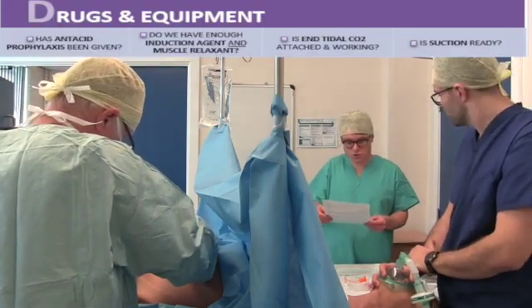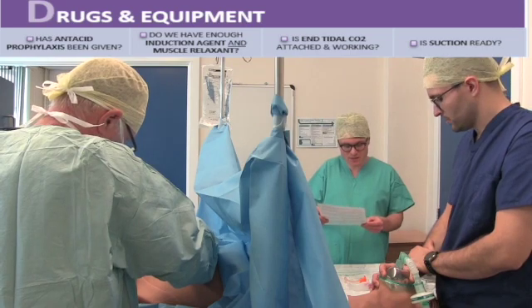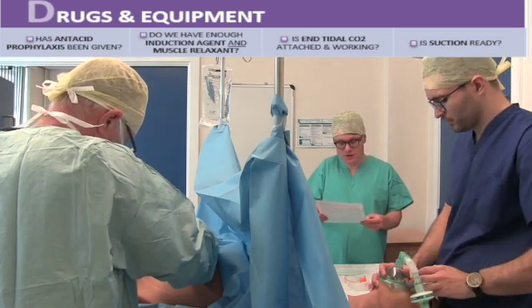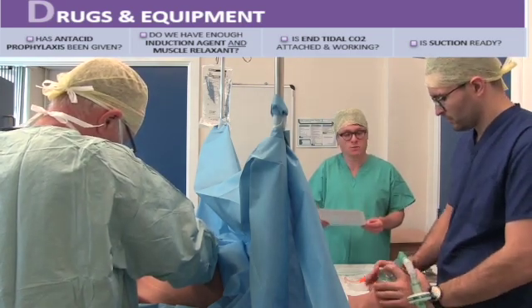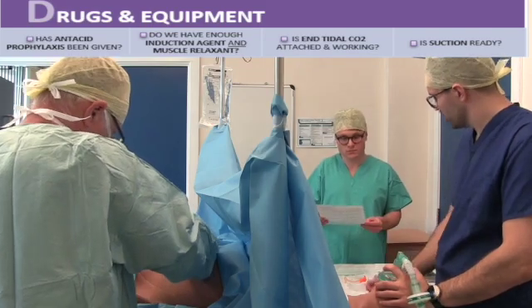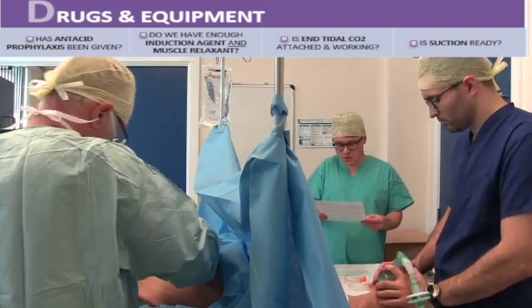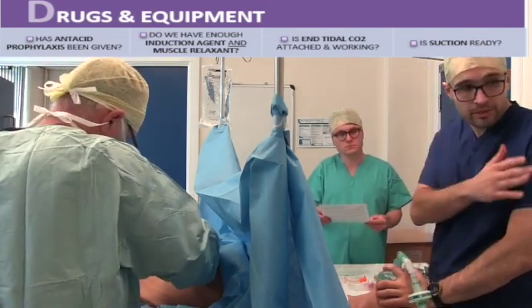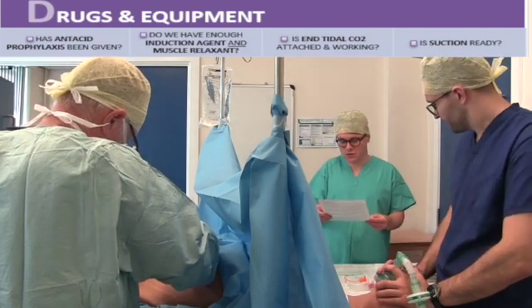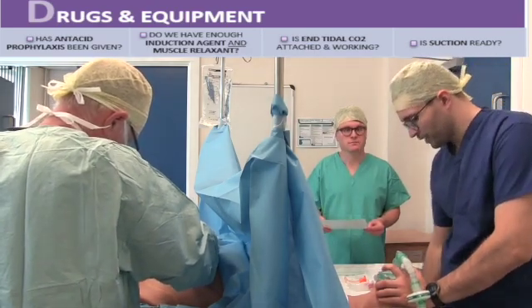And final section, drugs and equipment. Has antacid prophylaxis been given? Yeah, before we came in the room. Do we have enough induction agent and muscle relaxant? Yeah, so I've got thiopentone and rocuronium. And is end-tidal CO2 attached and working? Yeah, that's working already. And finally, is suction ready? Yeah, I've got suction here.